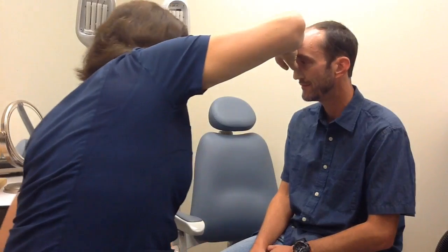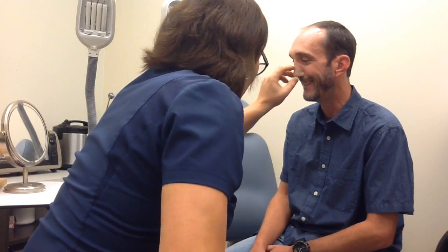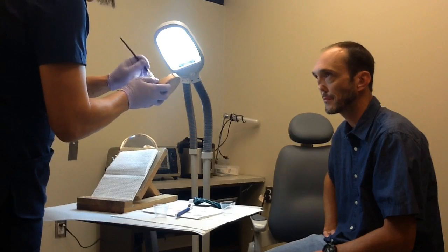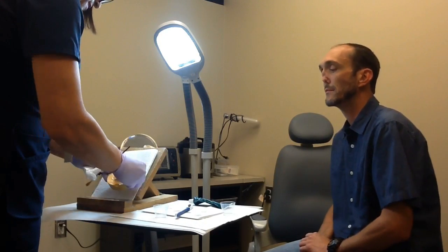Actually, it holds out a little bit right here. Really like that. And you see, it'll be also how handsome you're going to look. Okay, so let's do it. I want to see the color real quick on that — I'm kind of liking the color. But if we need to make an adjustment, we'll do it after this one, that way I don't mess up anything I like, right?